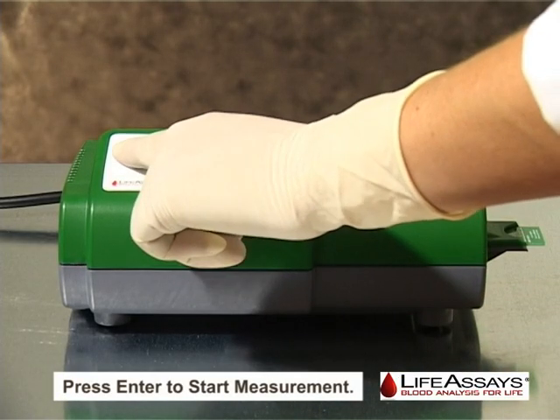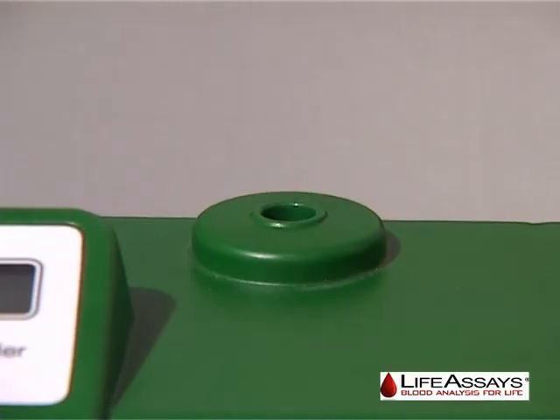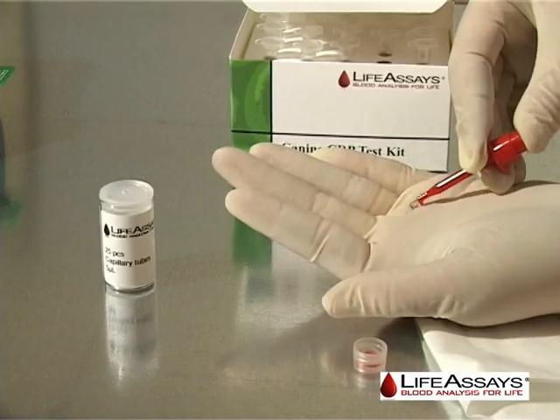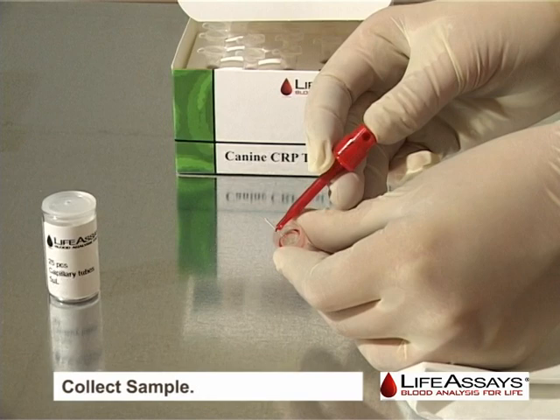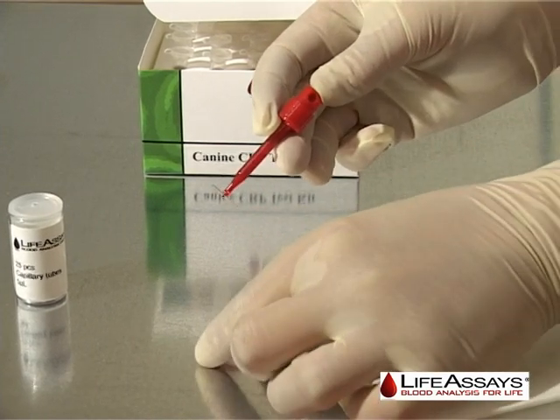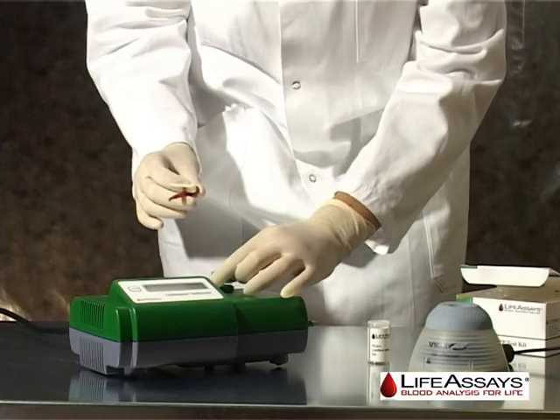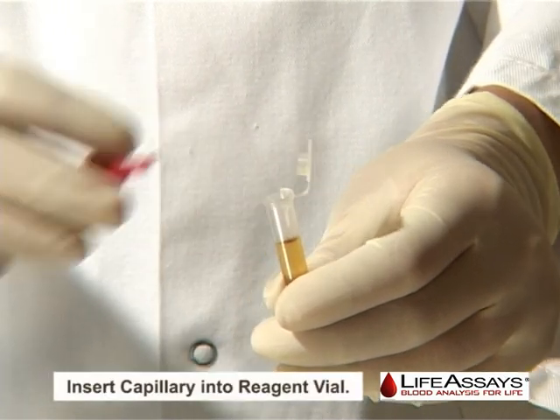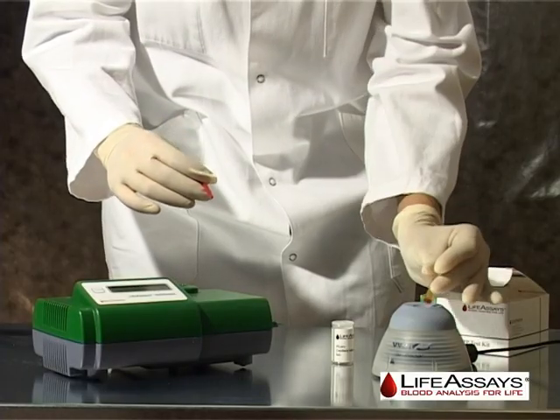Start the measurement by pressing and holding the enter button. Once instructed by the display, load the reagent vial. Collect your sample using a glass capillary provided in the reagent kit and a capillary holder. Unload the reagent vial from the instrument, open the reagent cap, and drop the glass capillary into the reagent vial.